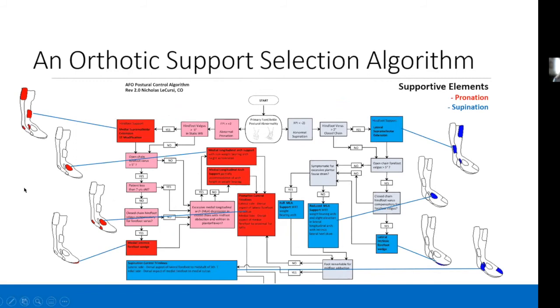Again, we had that whole list of candidate supportive elements within the orthosis. And as I said, I've selected out ones that I thought were in my practice, the evolution of my practice. I've not gotten too fancy. I'm using more of a chainsaw than a micrometer, so to speak. The idea is that with orthotics, sometimes we need the most grossly influential attributes in these devices in order to have something substantively visual and impactful for the patient. At least that's my experience.